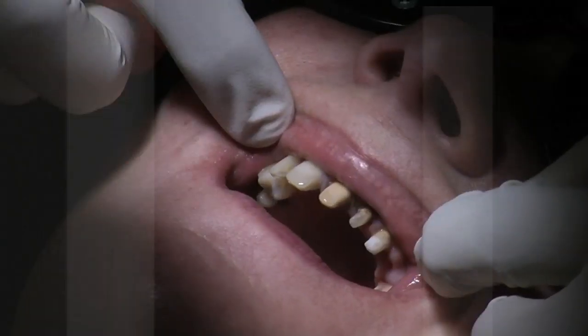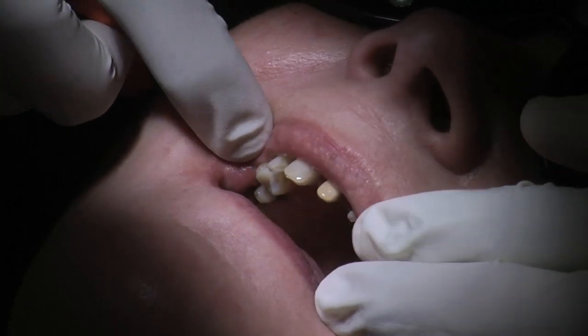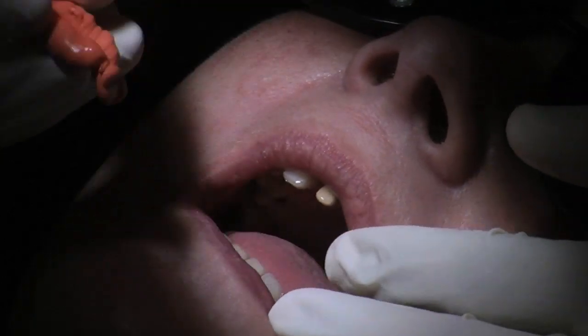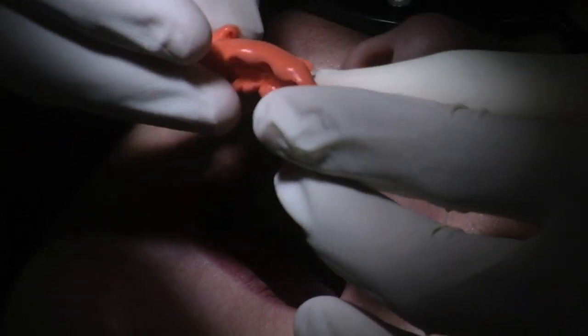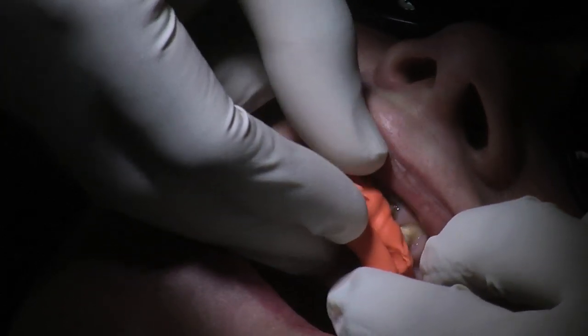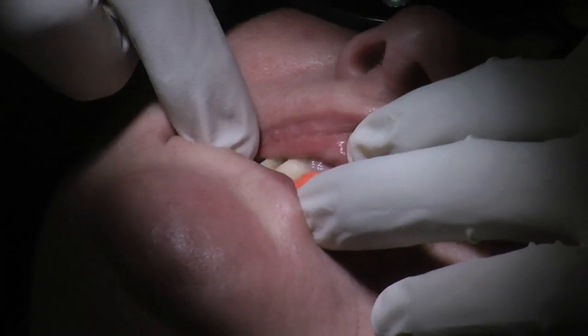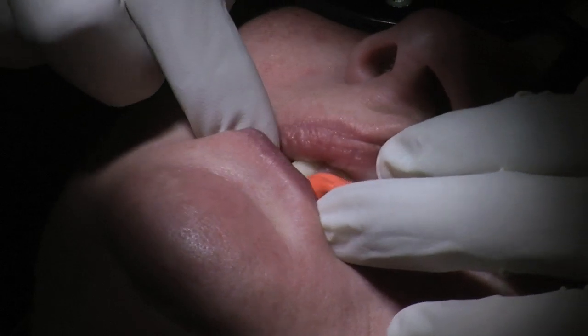Before I take the master impression, what I'd like to do is just take a few of the other basic records required for a small makeover. We might as well finish the interocclusal bite registration. So this was a sectional left side for this area here, which I'll ask the patient to bite together please, Dina. And she goes exactly in the right position, which is good.